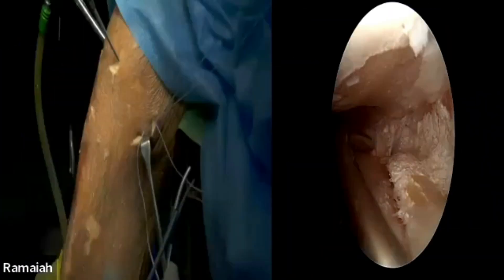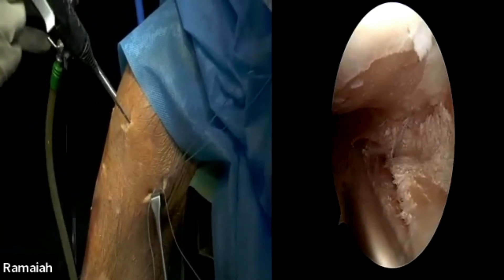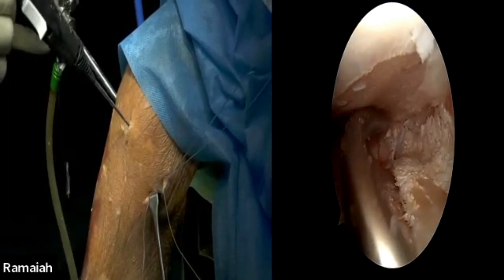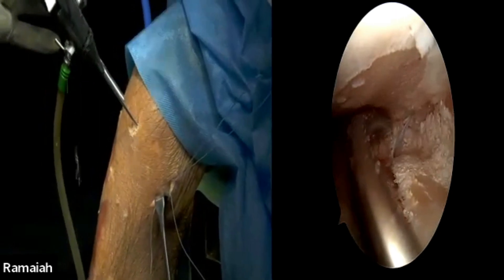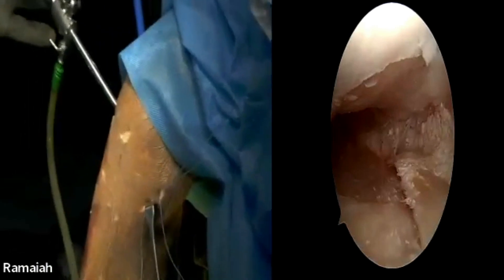This is the ideal suture pattern for a cleavage tear — where there is a parameniscal cyst or similar. You close that cleavage with one suture going above on the superior leaf of the meniscus and then below the inferior leaf of the meniscus, and try to bring the suture material outside through the capsule membrane here.